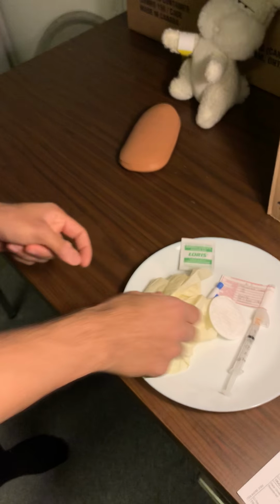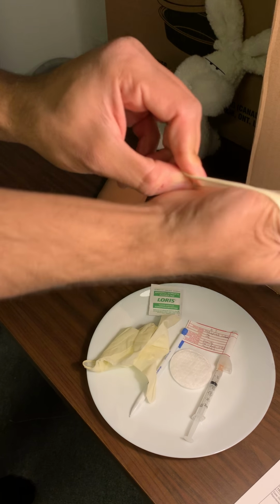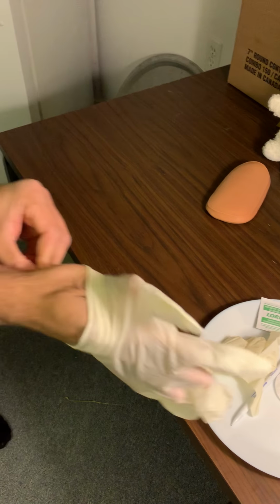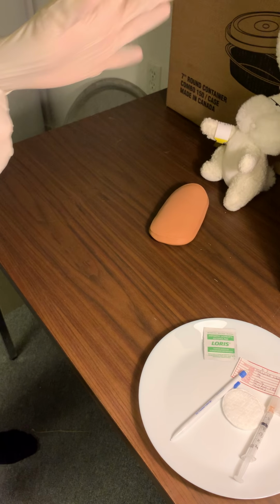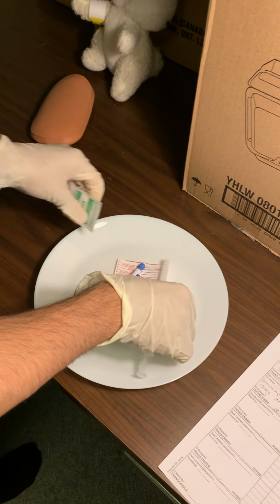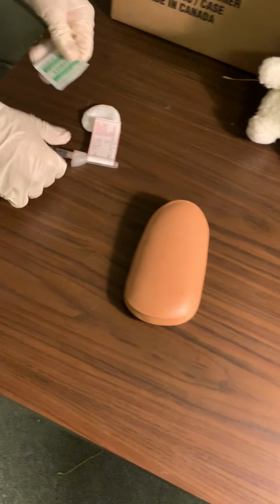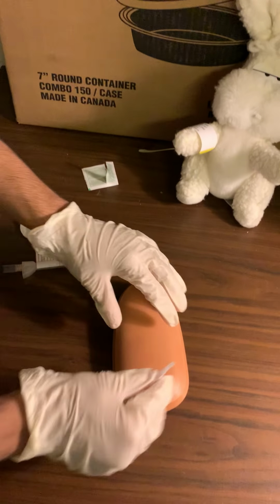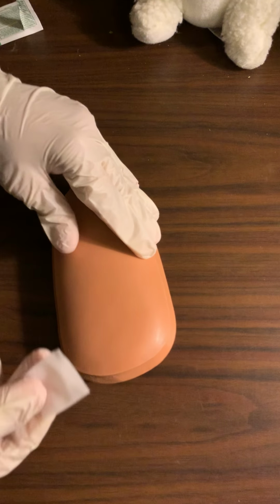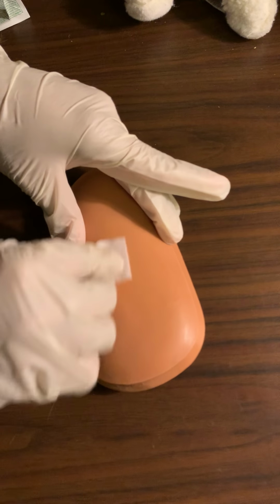Okay, and once I've landmarked, now I'm just going to quickly do hand hygiene before I put on my clean gloves. Okay, and now I'm just going to take my supplies to where I'm going to be injecting. Opening this up. Just going to be discarding this. First, I've already landmarked where I'm going to be giving it in the lower abdomen. I'm just going to be wiping the top where I'm going to be injecting for 30 seconds in a circular motion.